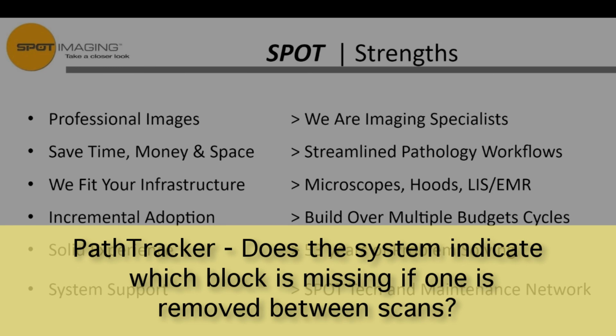is that if we do a scan and let's say either there's tissue or formalin or it's badly printed on a barcode and we miss it, the current release of the software that we're going to have, we don't have yet an identifier that will actually put a box around that barcode that we missed. That's a project or a feature that they're working on so that you don't have to play Where's Waldo. You're going to have something like in red that's going to pop up in the future. It's just not finished in the development cycle yet.